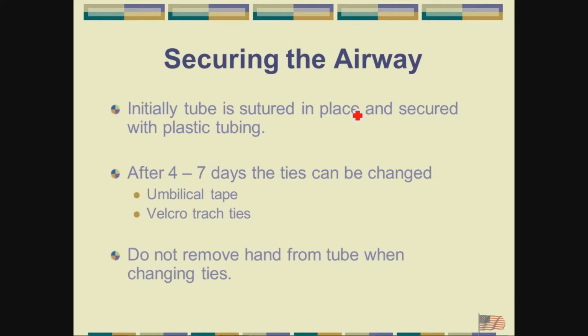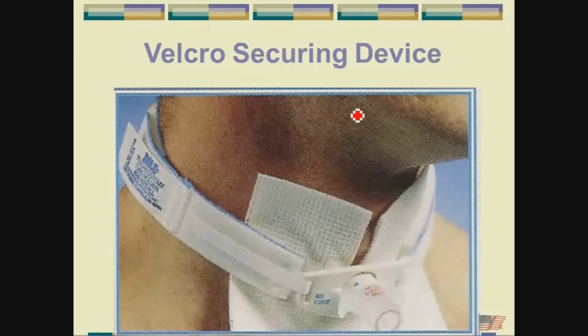And obviously, just like an endotracheal tube, now this would never happen in real life, that the patient would cough while you have that trach. Just cough the trach out. Oops. So these are what the Velcro ones look like. So here's my one part of the Velcro that attaches to this cloth part here.